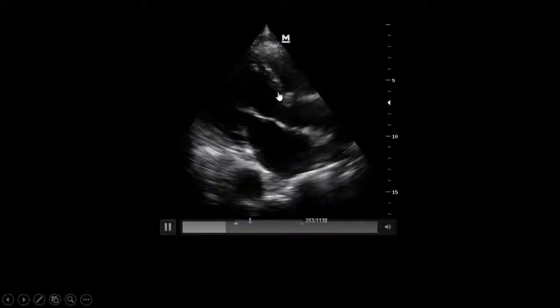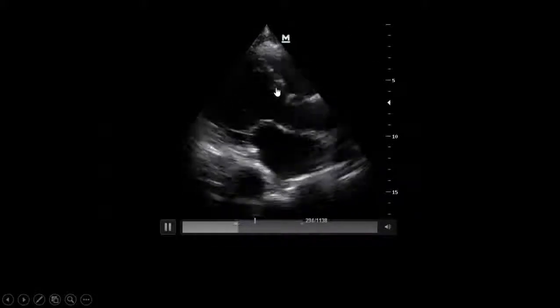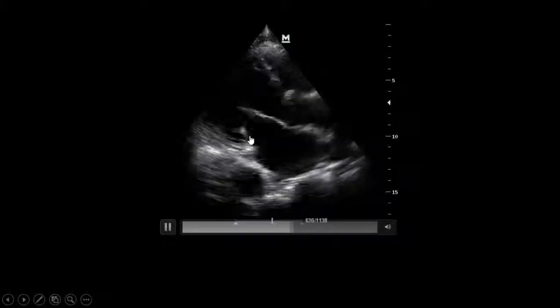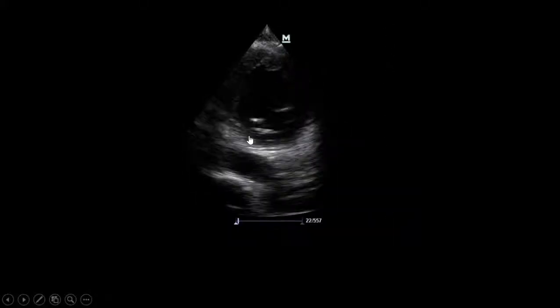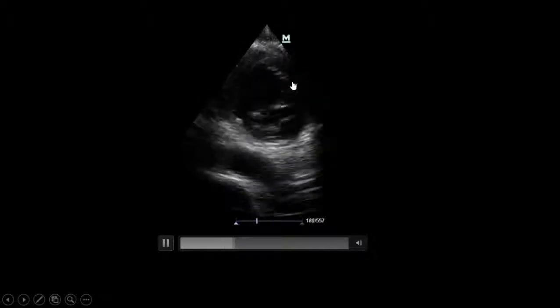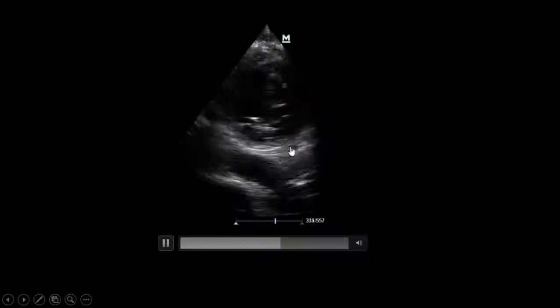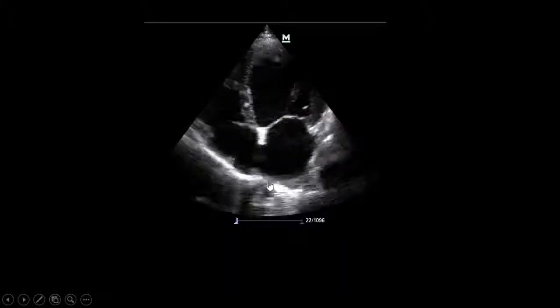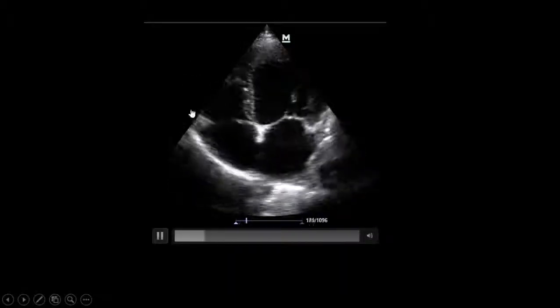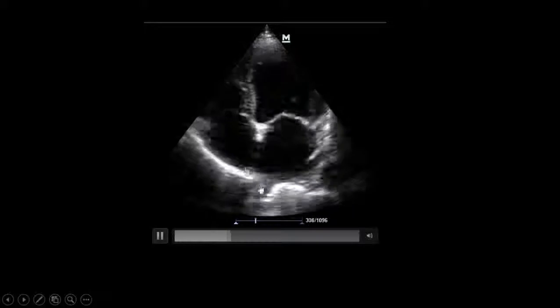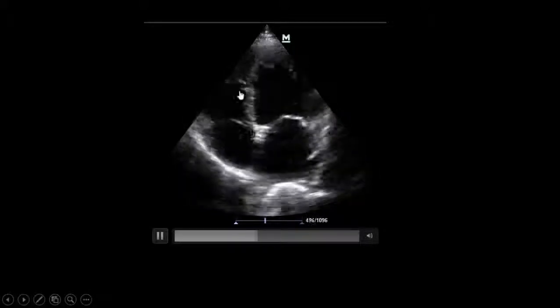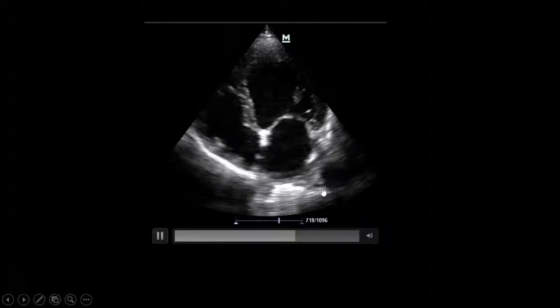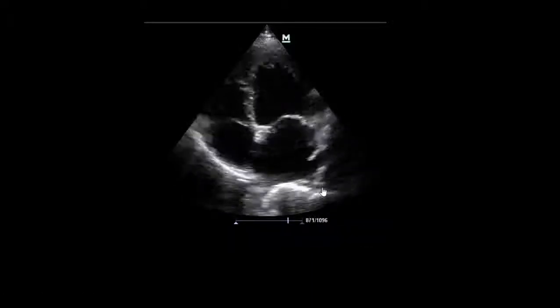Parasternal long axis view shows very weak contractility and a dilated left atrium. Short axis view confirms ischemic dilated cardiomyopathy with poor contractility. The four-chamber view shows a dilated left atrium and left ventricle, consistent with ischemic dilated cardiomyopathy, which explains the full IVC.